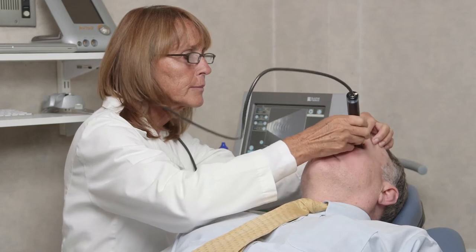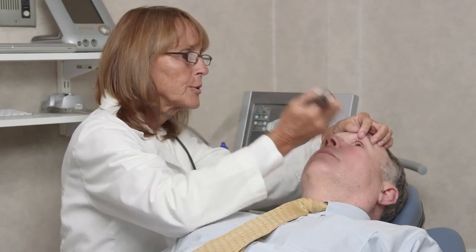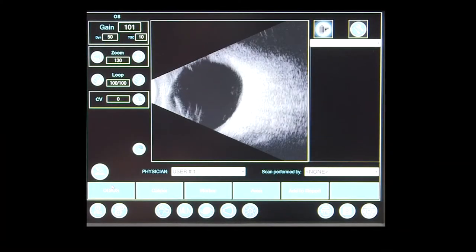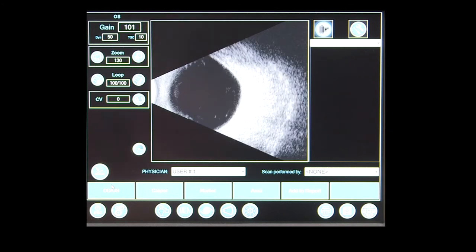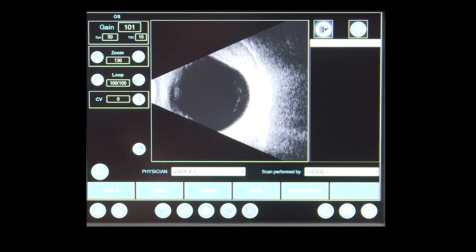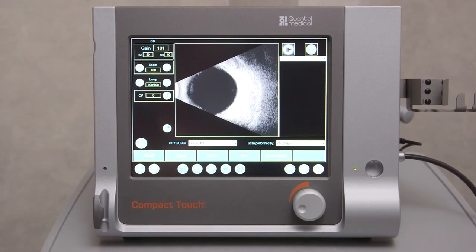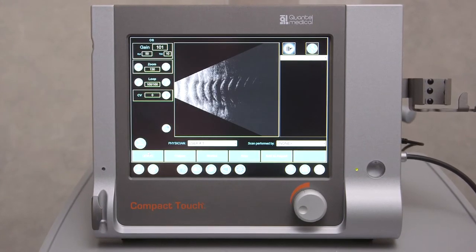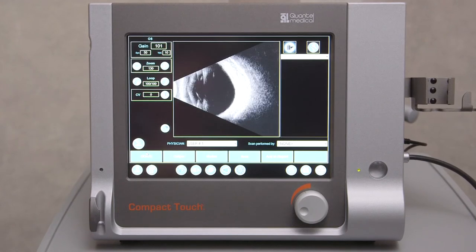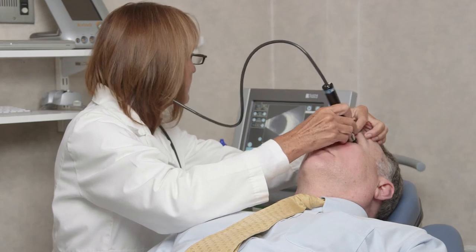Keeping in mind that the center of the sound beam provides the best detail, an oblique transverse scan is used to center pathology located in the superotemporal, superonasal, inferonasal, or inferotemporal quadrants. This is performed in the same manner as the transverse scan, only the marker on the probe is positioned upward at an angle. If the area of interest is located superonasal or inferotemporal, the marker should be directed superotemporally. If the area of interest is located superotemporal or inferonasal, the marker should be directed superonasally.